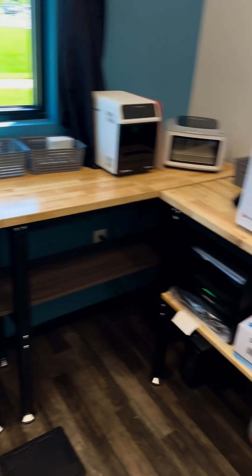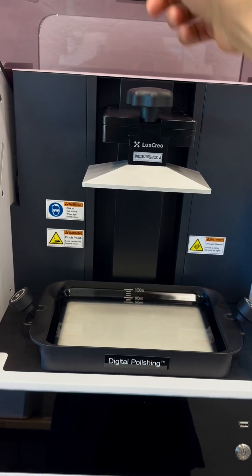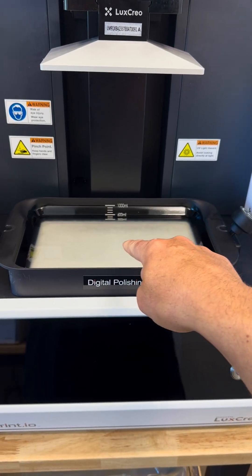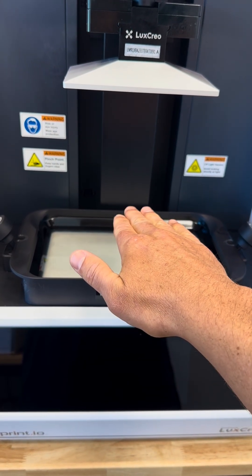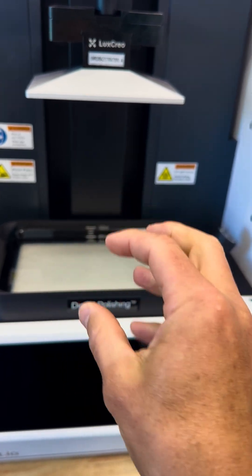When we're done, we send it across the room to our printer. Once we get everything sent to this — this is called a build platform — it lowers down into a vat of resin and then slowly rises up out of the goo. There's a little light down there that creates individual shapes and layers, and it just builds and builds.